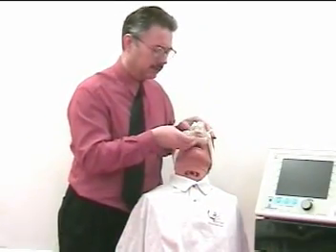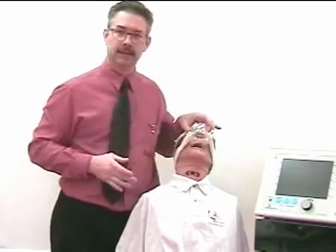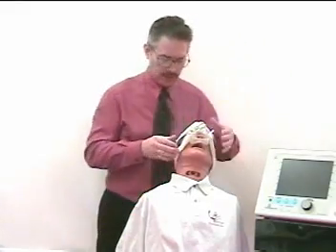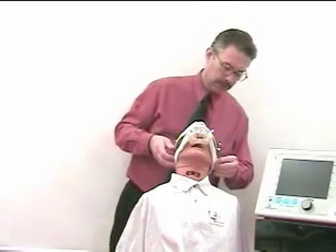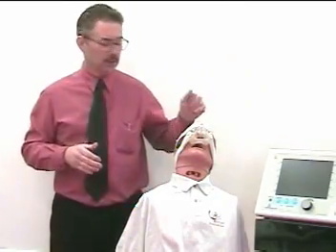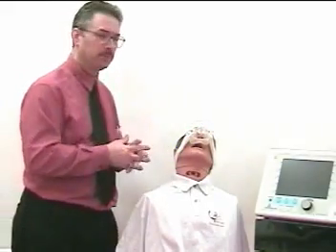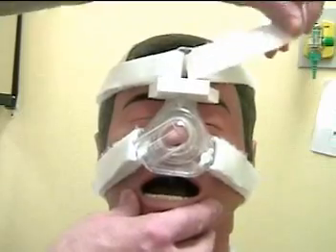And make sure that it is not falling over the patient's bottom lip, and that it's not gapping over the patient's eyes. Make sure all the straps are straight. Tighten it slightly. Don't over-tighten it because that'll be a source of discomfort, just enough to eliminate any gaps. At this point, then, you will be ready to connect the tubing from the BiPAP or CPAP system to the inlet of the mask.